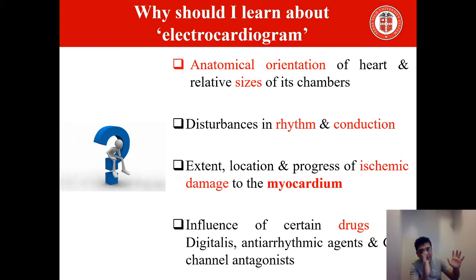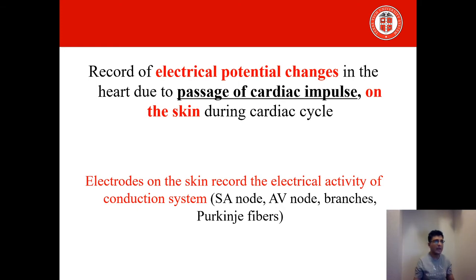So if we summarize this whole slide, we can talk about the anatomical orientation, different sizes of the chambers of the heart. We can diagnose arrhythmias, we can diagnose ischemic changes, and can appreciate the effect of drugs on the heart. Let's move on.